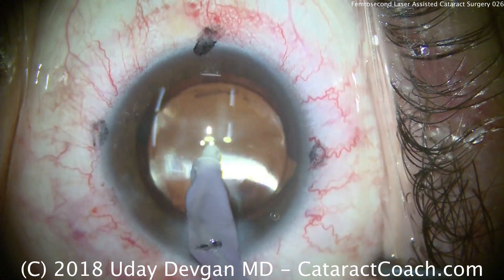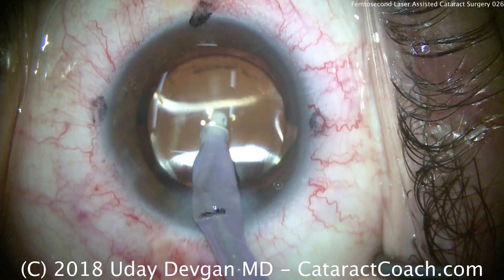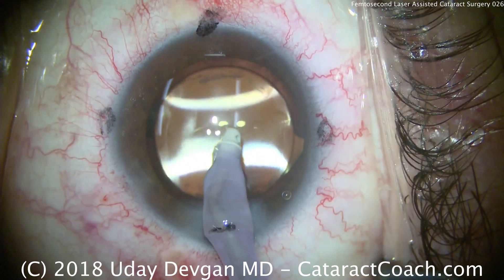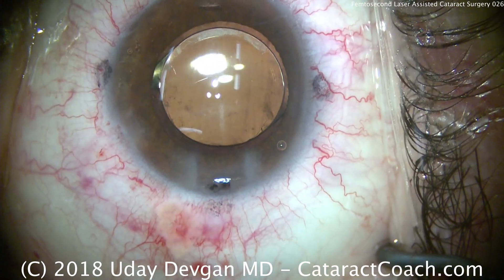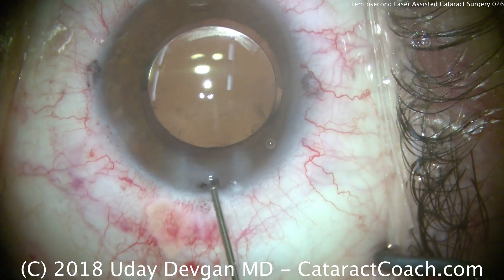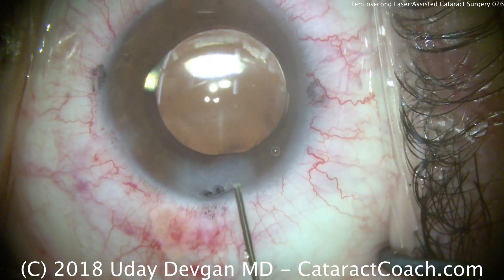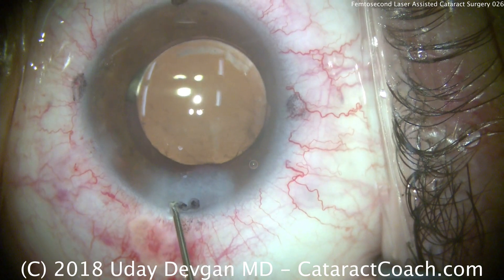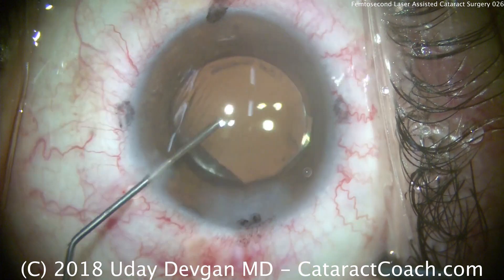That looks good — we're coming toward the end of the case. All that remains is sealing up the incisions. So there you have it: we can certainly use a femtosecond laser for cataract surgery, but it can be hard to justify the additional cost. It's significantly more expensive — about half a million dollars for the laser, plus at least a few hundred dollars per patient in usage fees, often higher. In this case, it wasn't particularly beneficial, but in certain cases it could be.